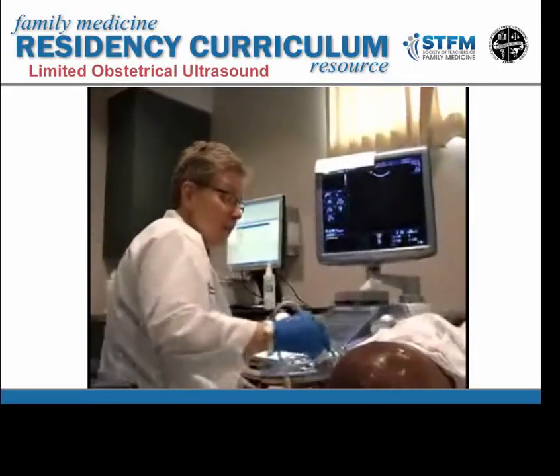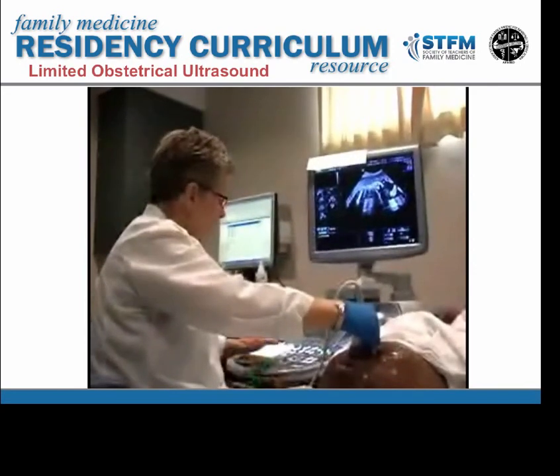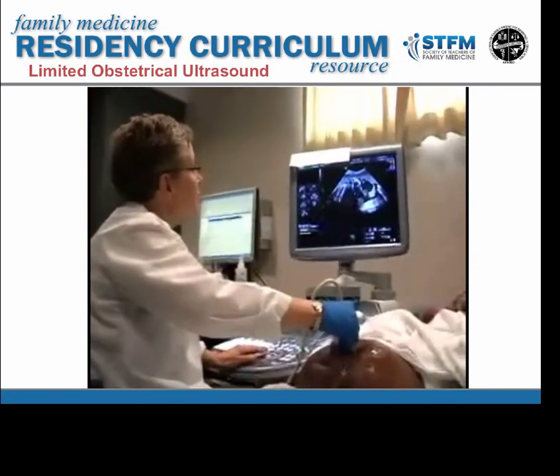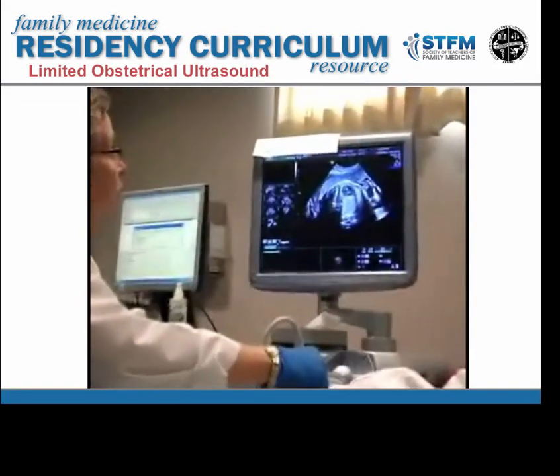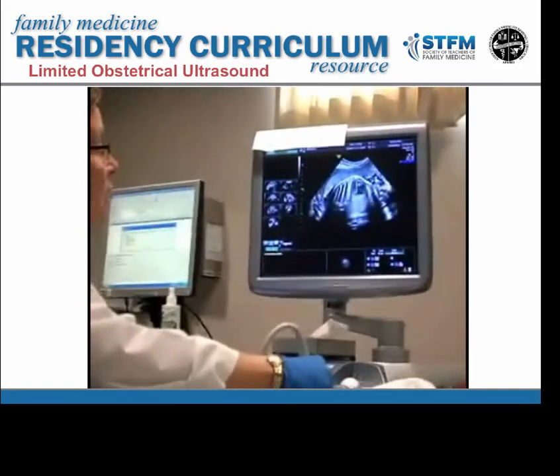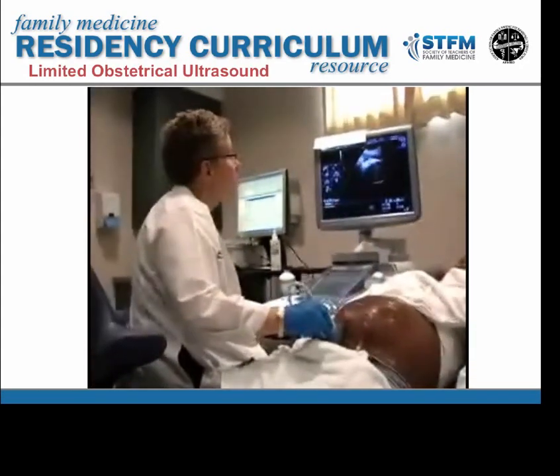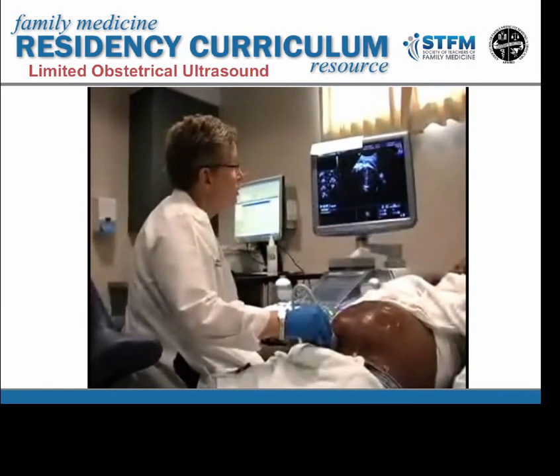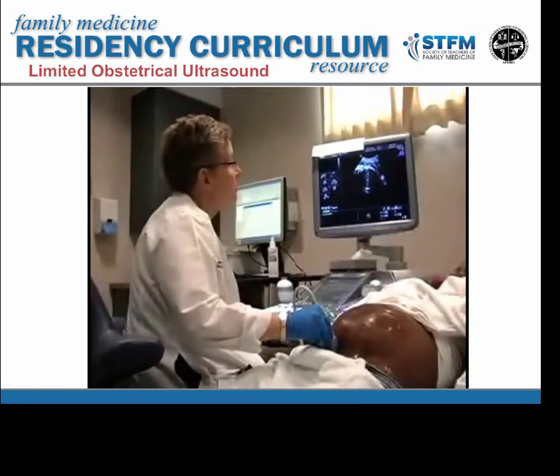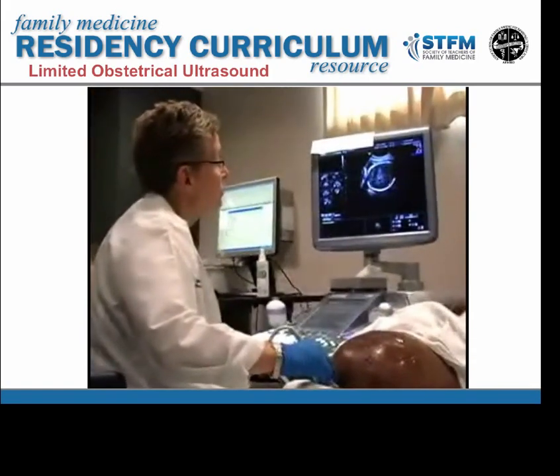Good morning. The first thing we do when we come in is you'll of course want to always check to make sure you have a live fetus. And in this case you can see that there's a normal fetal heartbeat up here and a fetus that is active. Next, to check presentation, I put my transducer down just above the pubic bone and I see what's presenting below. So by the orientation, this is the cervix, this is the maternal bladder and the lower uterine segment, and in this patient's case, this fetus has a head coming first.